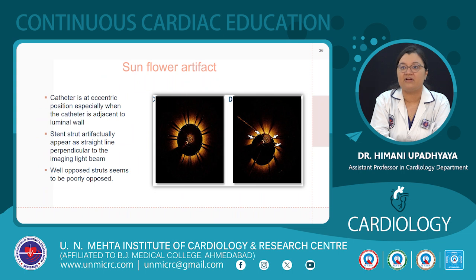Then there is sunflower artifact. After stent placement, when the catheter is at an eccentric position, especially when the catheter is adjacent to the luminal wall, stent struts artifactually appear as a straight line perpendicular to the imaging light beam, and hence well apposed struts seem to be poorly apposed.